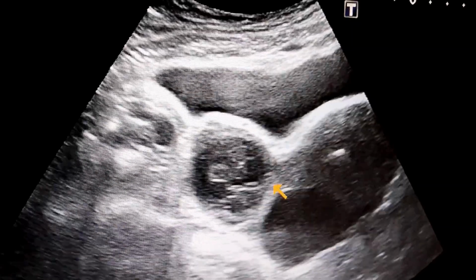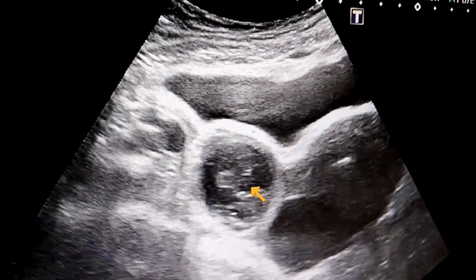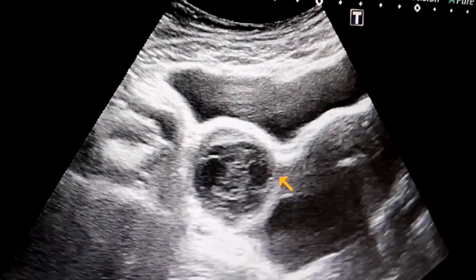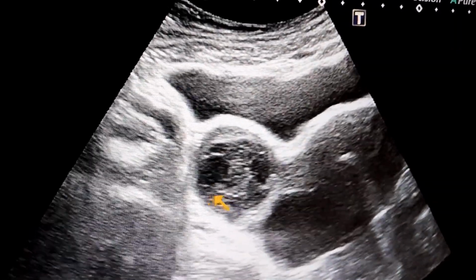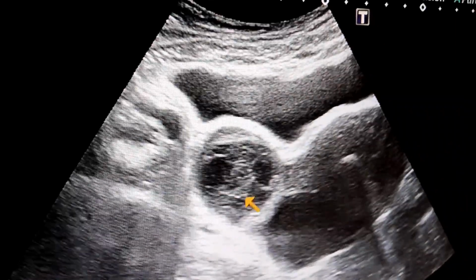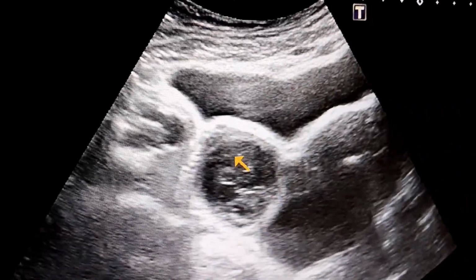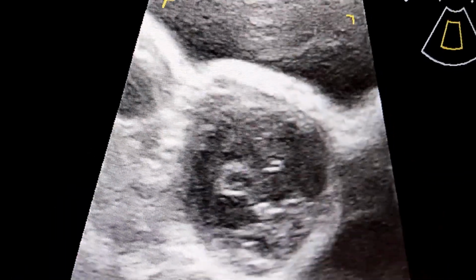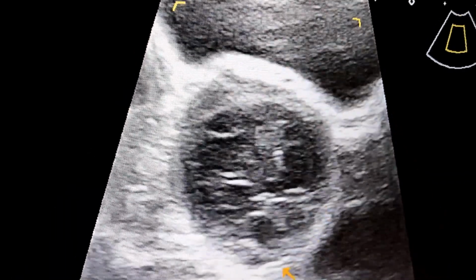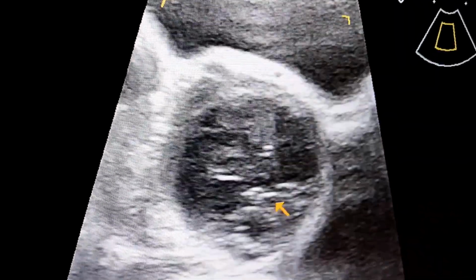So I'm going to show you in the real images and the real ultrasound. Here we can appreciate this linear dot line. I'm going to zoom it. So now we can have better visualization of this cystic lesion.